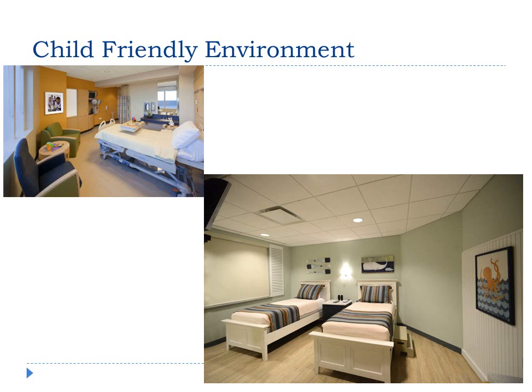Along with this, you want to have the safety cover plates over all your electrical outlets. If you're doing a sleep study on a baby that needs to sleep in a crib, have a crib there for them where your equipment can get to it easily. But again, you want to keep the equipment out of sight. This reduces the anxiety and fear in the child, and again, it makes them more comfortable and feels like the environment is built for them, not for an adult. Let's go on to our next slide.